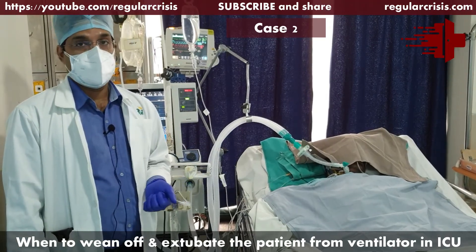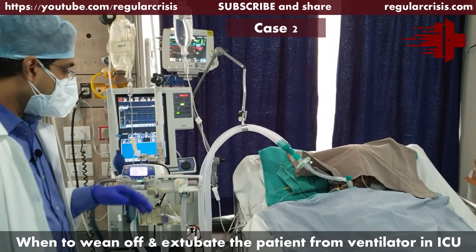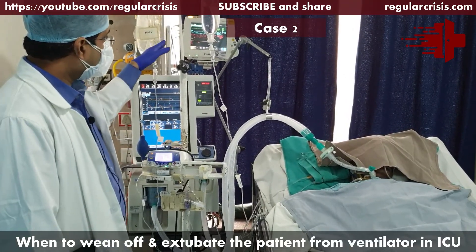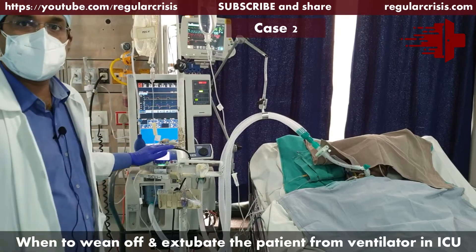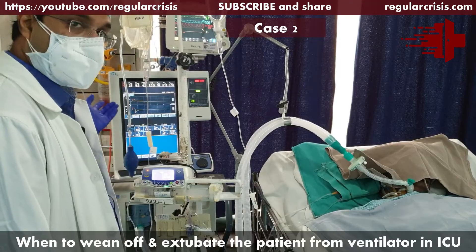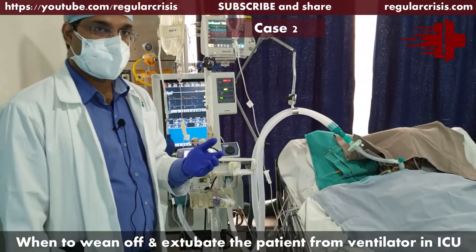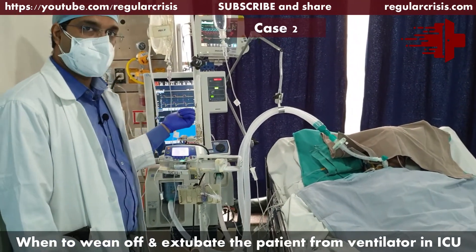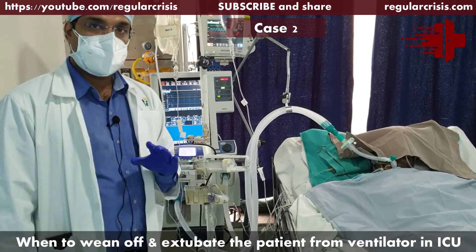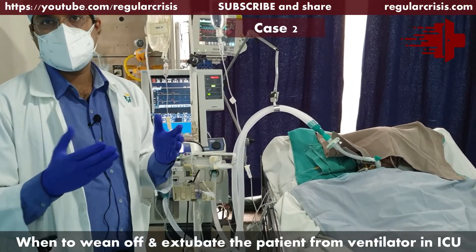He is not able to cough out secretions — that's why we need to do a tracheostomy in this patient. Third, hemodynamic stability: the patient is currently on 7 mls of noradrenaline infusion, though blood pressure is being maintained and this is showing a decreasing trend — we are tapering the vasopressor support. Fourth, the ventilator settings and blood gas: FiO2 is 60%, PEEP is 5, and in the ABG he is maintaining PO2 more than 60. The patient is on spontaneous mode ventilation. PCO2 levels are fair and he is afebrile.